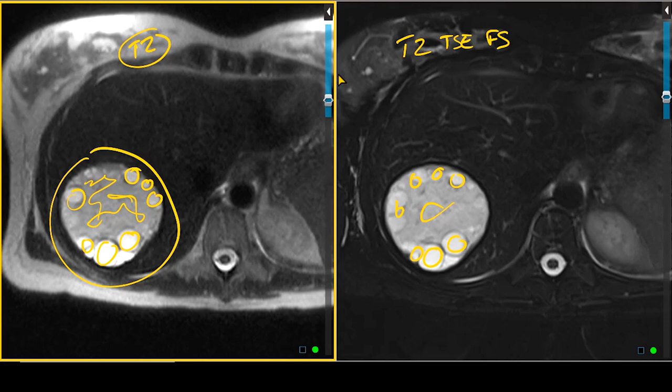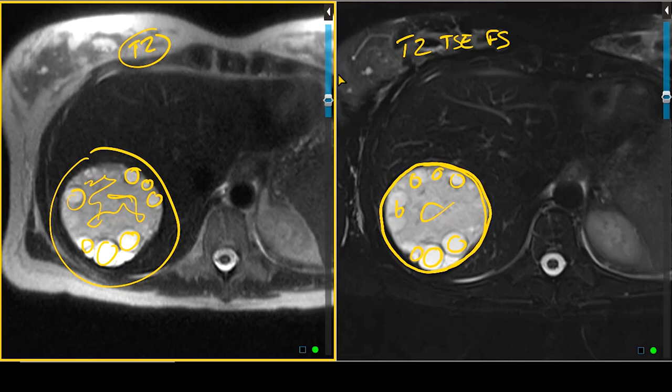Also noted is a very discrete T2-hypointense rim that surrounds the majority — in fact, all — of this mass. This becomes an important imaging finding in this patient. We did not perform many additional sequences and certainly did not give intravenous contrast, but this imaging appearance is quite characteristic of a particular type of abscess that can affect the liver.